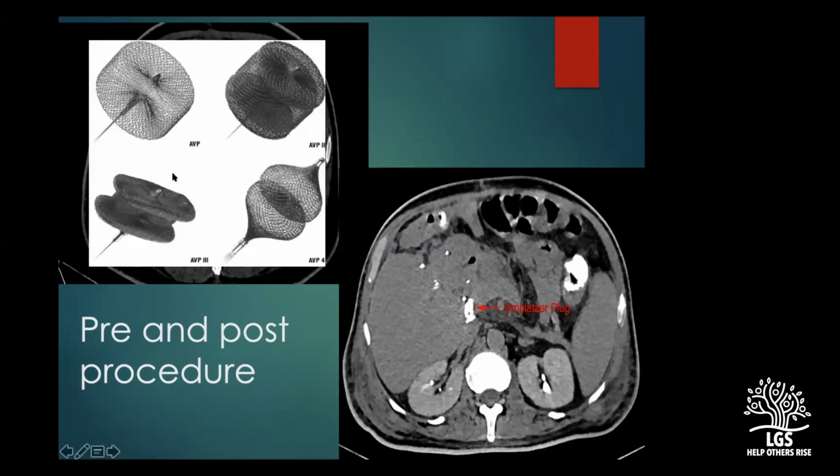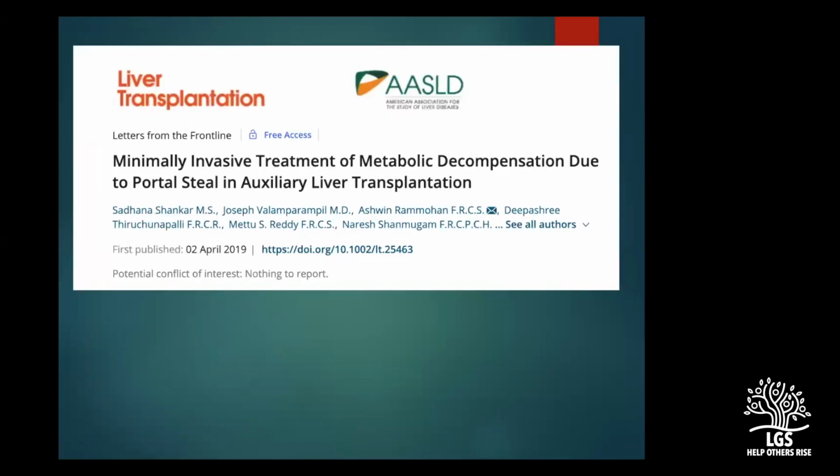And these are the different types of Amplatzer plugs which are available in the market, and we can choose anything, and we use one of these plugs to block off these shunts.